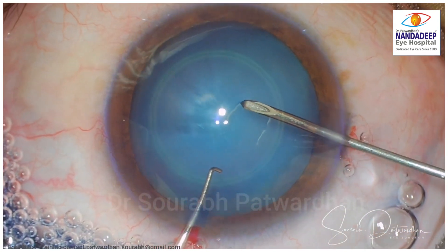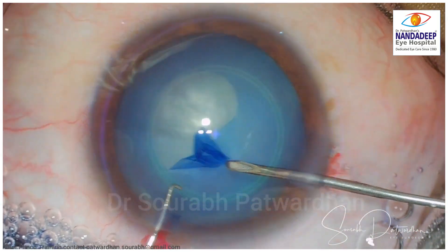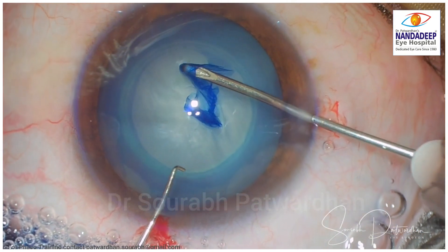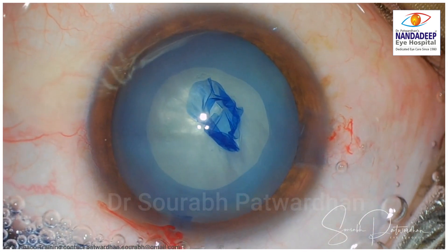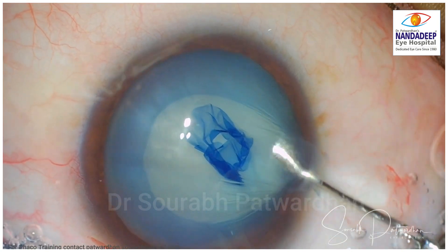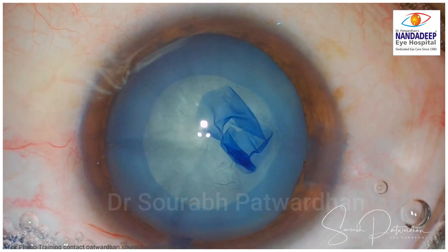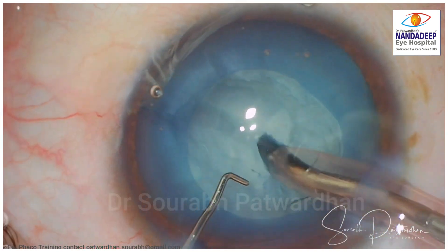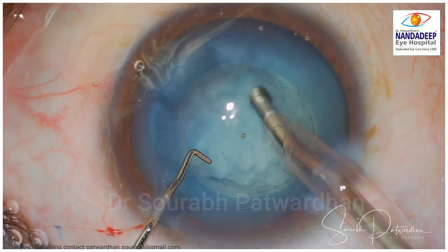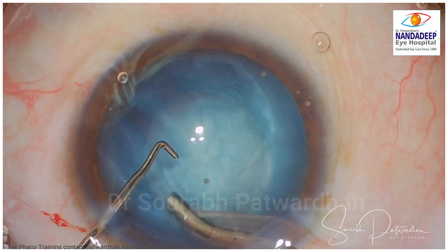It is a white cataract, not intumescent, and I am planning to do around 5.2 to 5.3 mm central CCC to have good centration of the IOL in the post-operative period. Whenever there is a history of trauma and also a unilateral cataract, we should always expect some unexpected things during the procedure. I did not do hydrodissection but pushed very minimal fluid under the anterior capsule just to have a little cleavage there. I am going to do trench divides. It is a very soft cataract and, being a white cataract, I expect the nucleus to start rotating by this point even without hydrodissection.